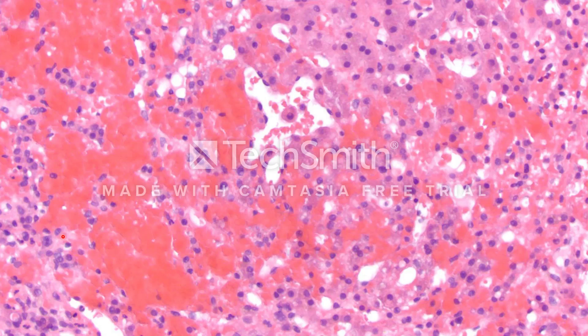Additionally, notice the hepatocytes — they look small and atrophic. And this is what Budd-Chiari syndrome does. The hepatocytes immediately around the central vein, remember that's where the maximum back pressure accumulates, those hepatocytes tend to get small and atrophic.